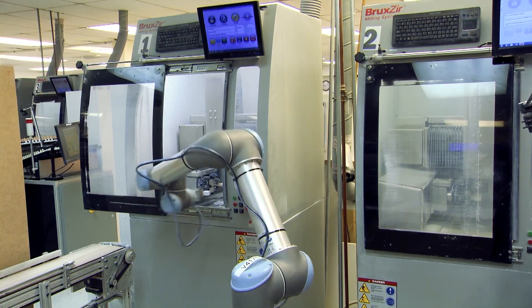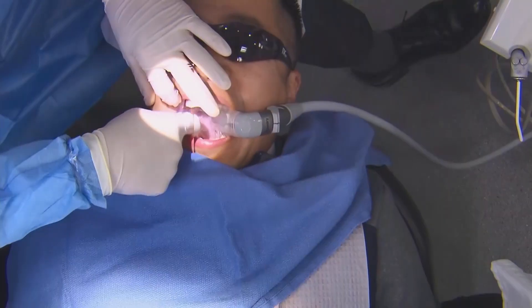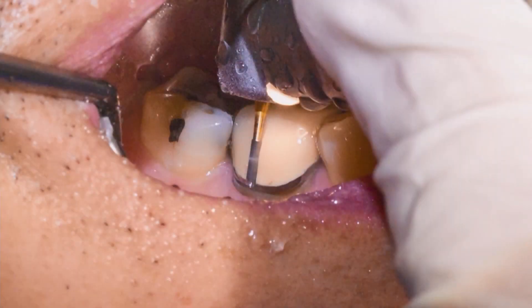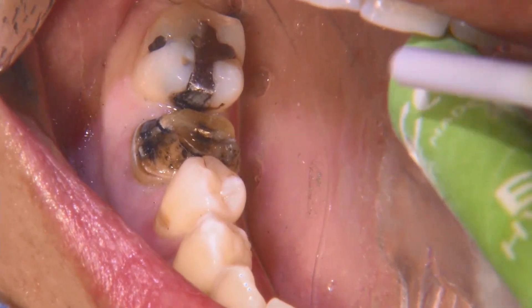You can see here the universal robotic arm reaching for one of the blocks depending on which shade is required. Here's the case. I'll introduce you to the preparation — it was a porcelain-fused-to-metal restoration on tooth number 30 with open margins throughout. We're going to first remove the old restoration. I was using the Isidry, a nice retraction and isolation tool, and then a screwdriver-type instrument — a Christensen removal tool — to separate that mechanical bond from the metal coping to the prep.